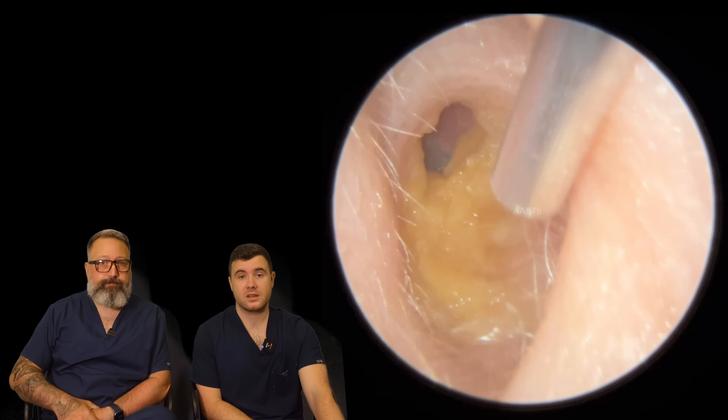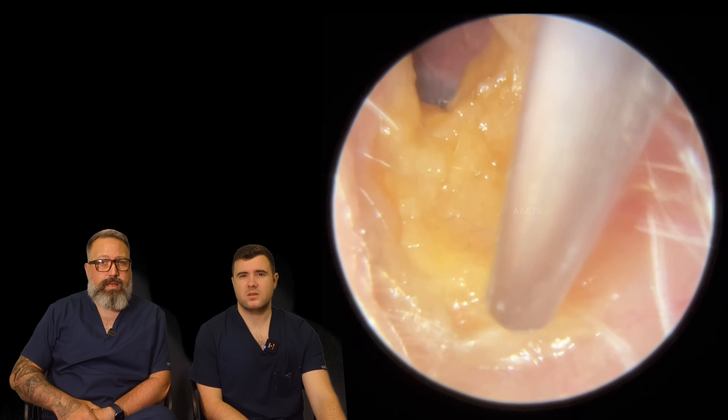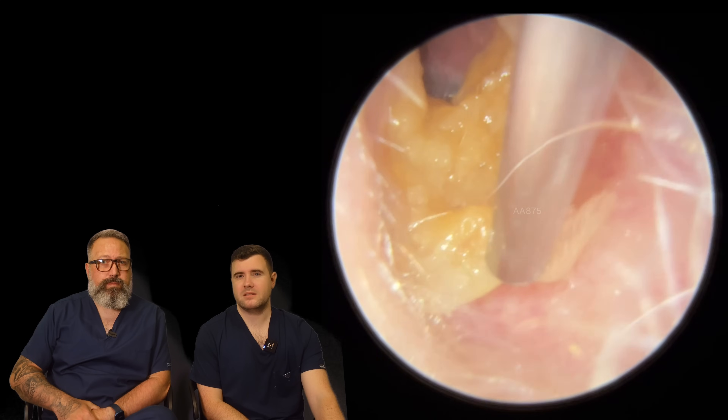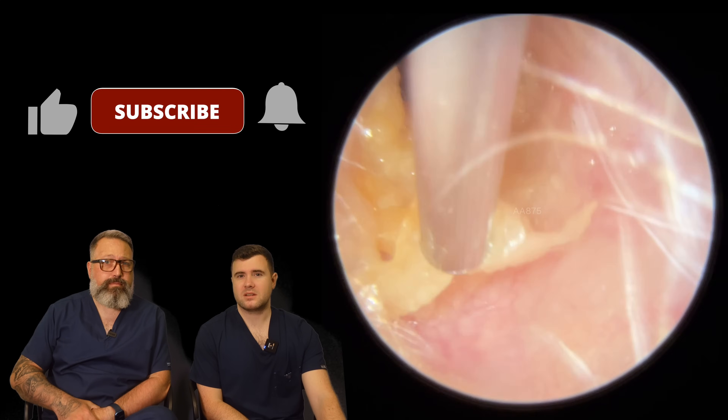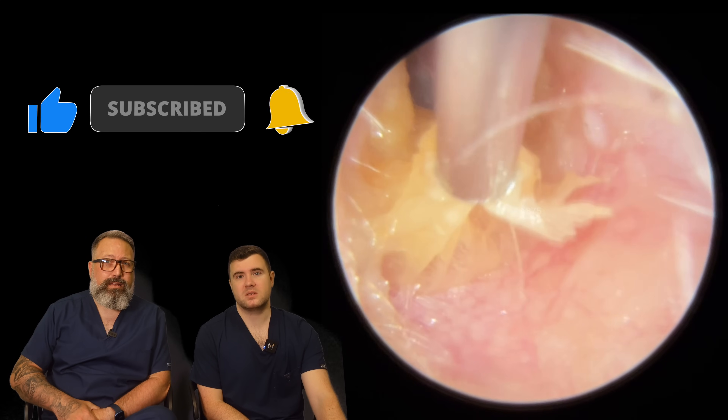So this is my patient. You can see we've got this very sort of almost like wet and sluffy kind of skin built up in this patient's ear canal.